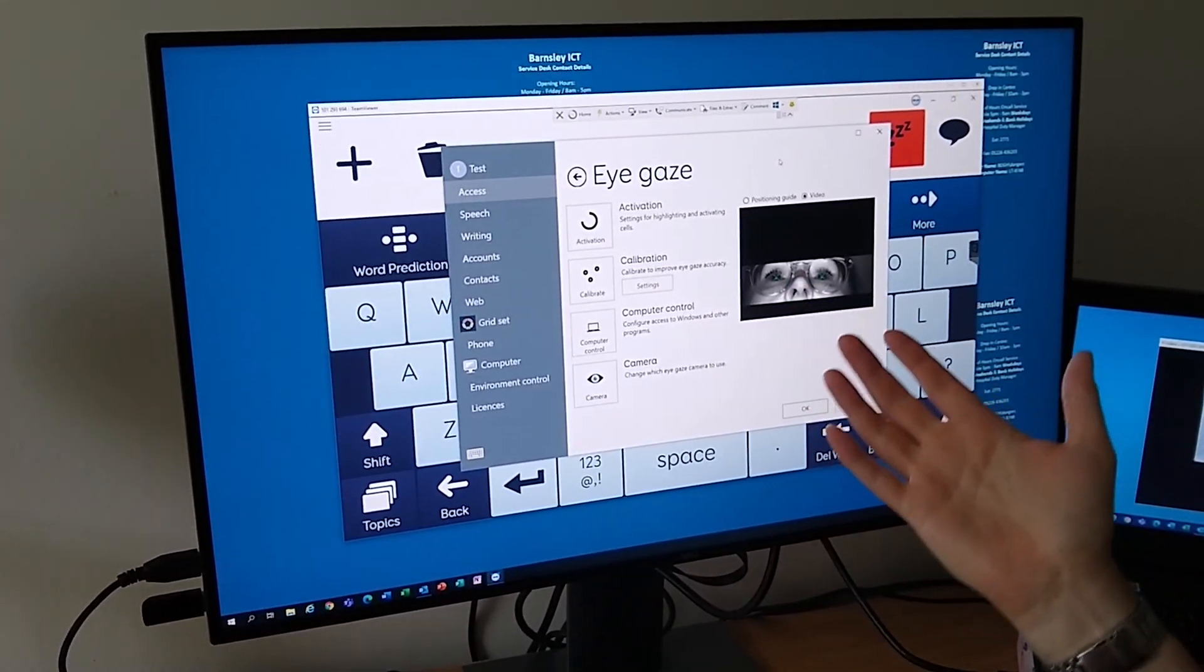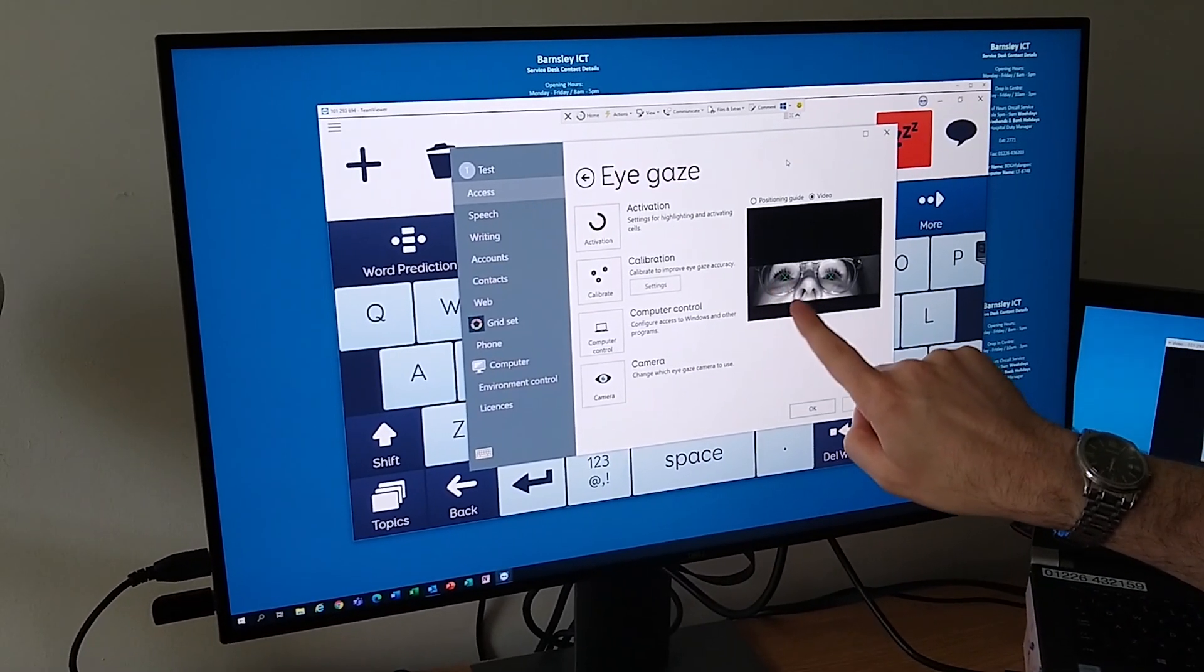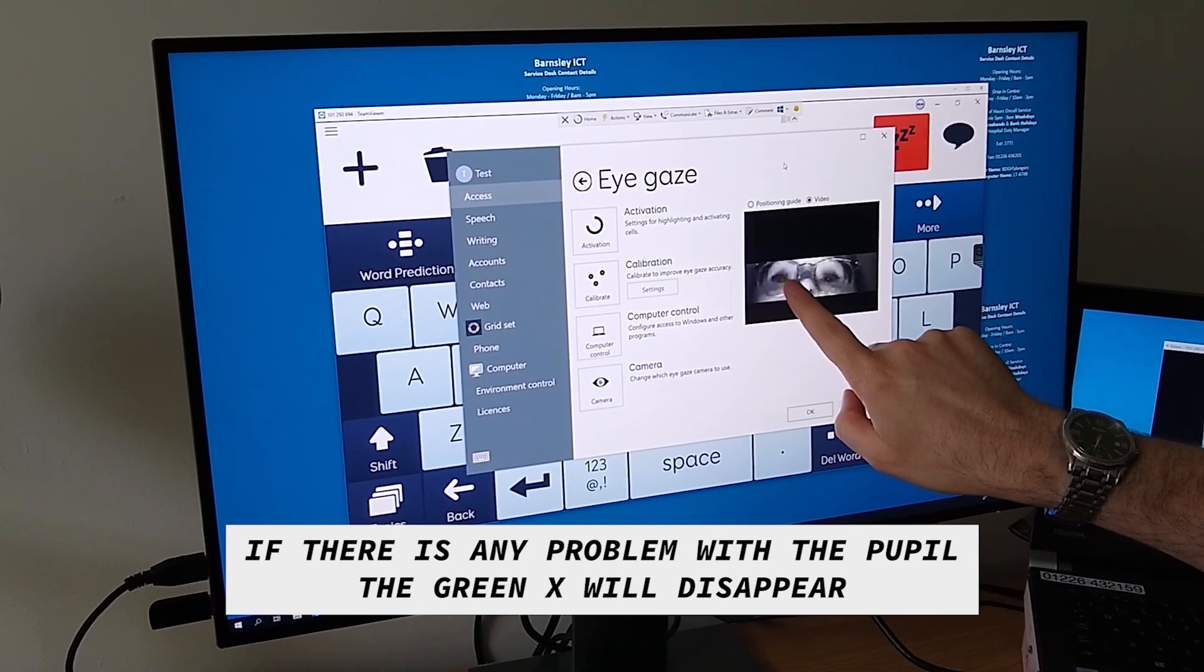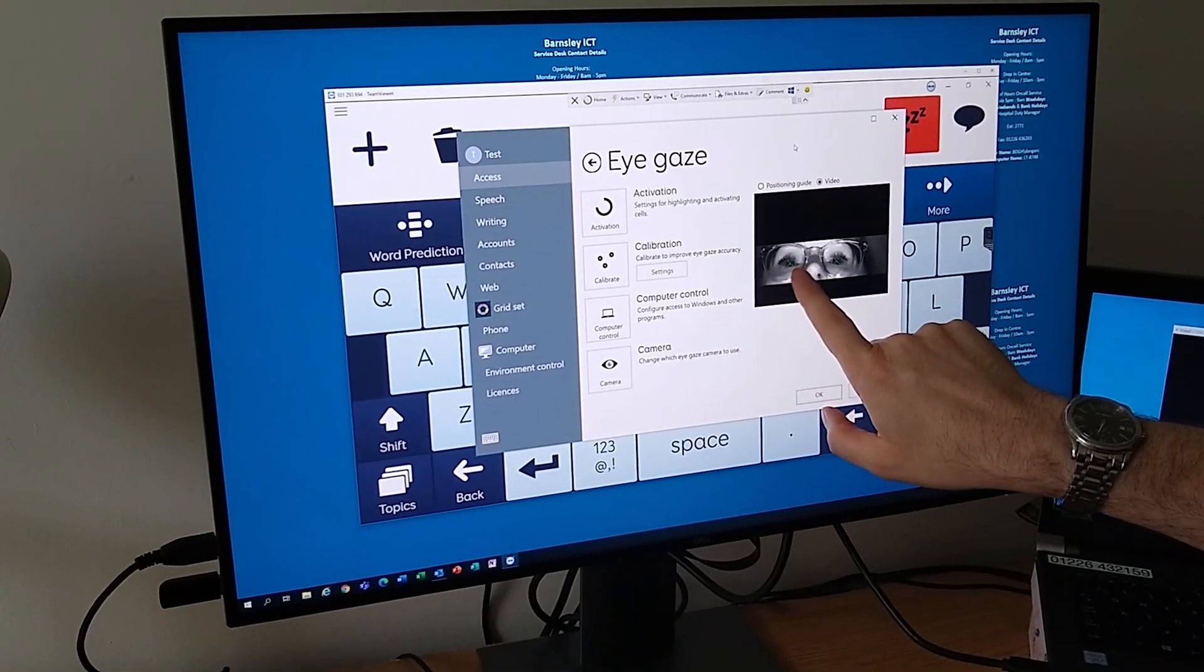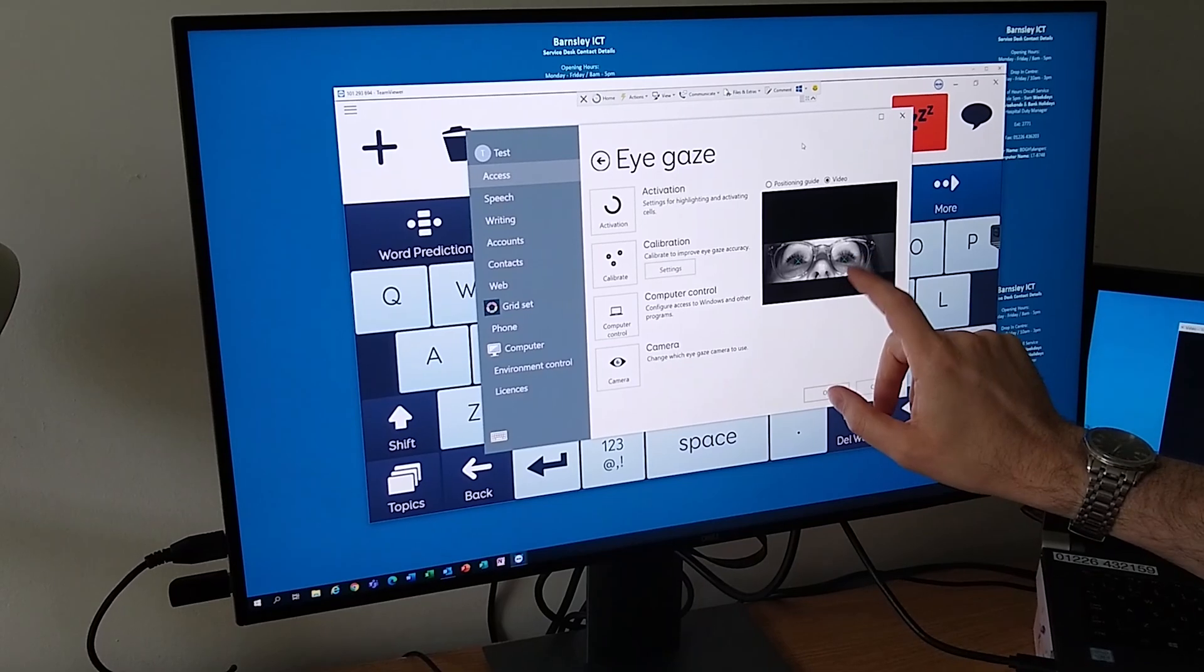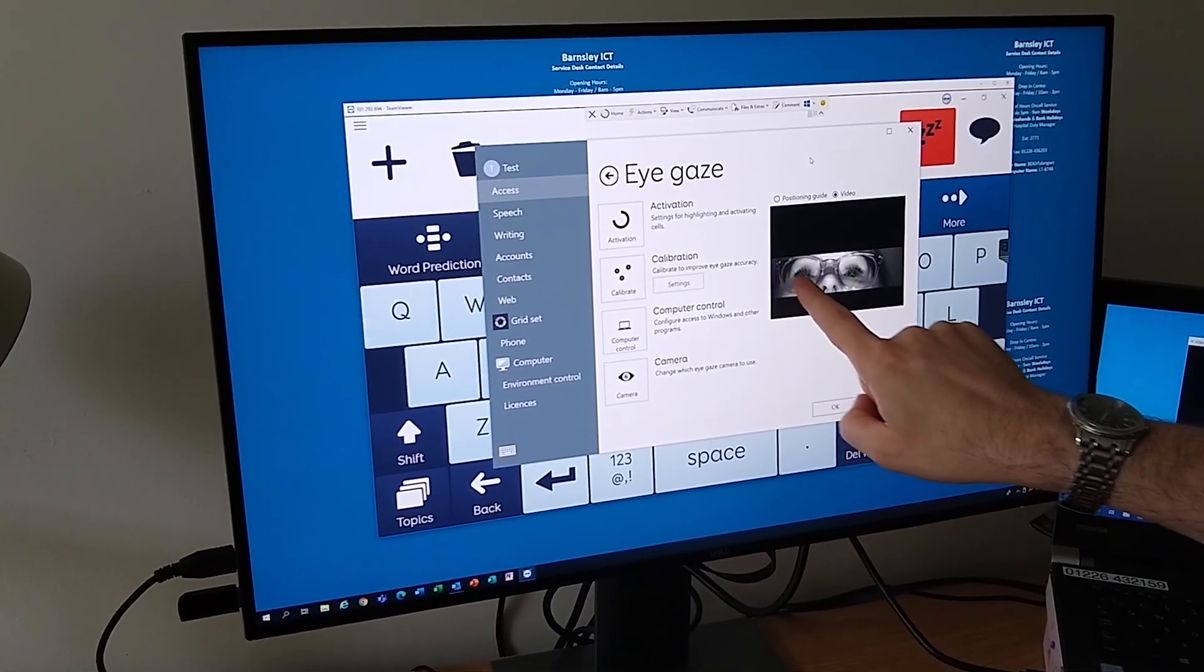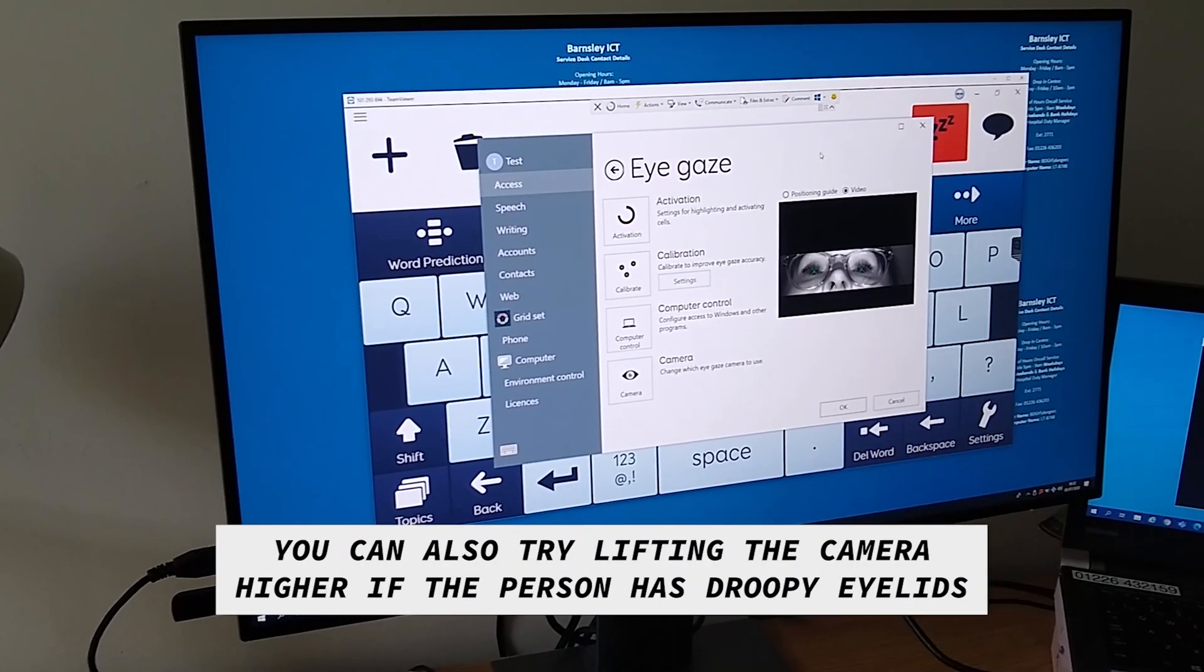What's also really useful in this image is we can see that there's no obfuscation of the pupil with the top eyelid or the bottom eyelid. That does happen sometimes, and if that does happen then you can just get the camera to follow one eye because often some people will have like ptosis, which is a covering of the eye in one eye but not in the other. But anyway, that's all working fine.